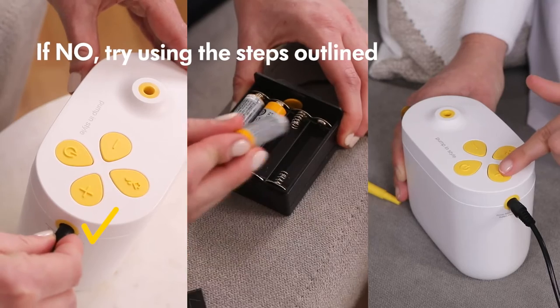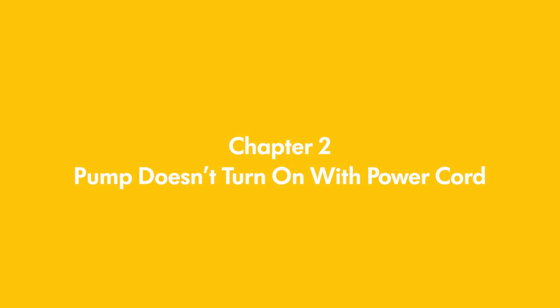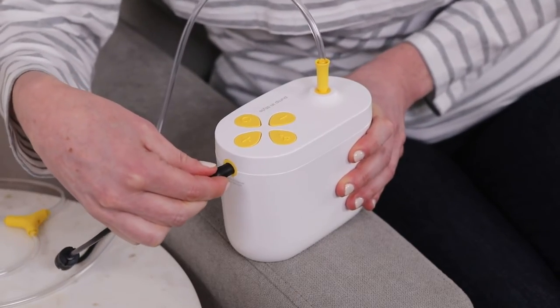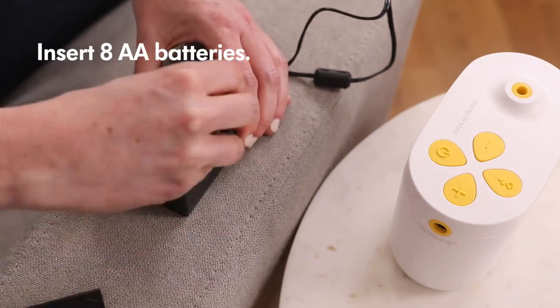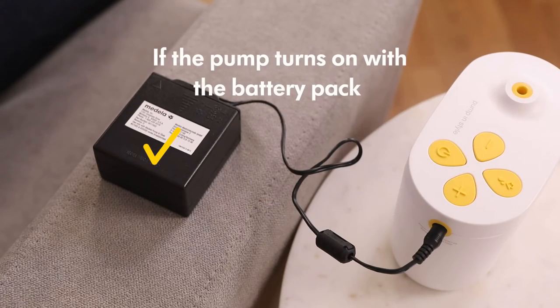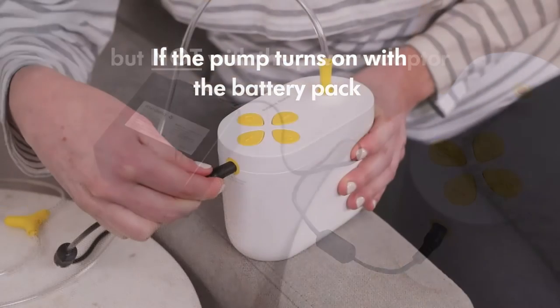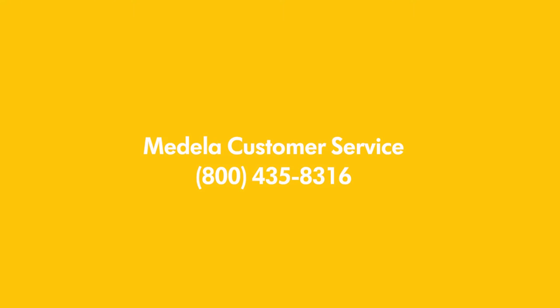If no, try using the steps outlined in each chapter of this video where your situation is applicable. If the breast pump will not power on using the power cord, try using the battery pack. Insert eight AA batteries into the pack and plug it into the breast pump, then power on the pump. If the pump turns on with the battery pack but not the power adapter, contact Medela Customer Service to replace the power adapter.